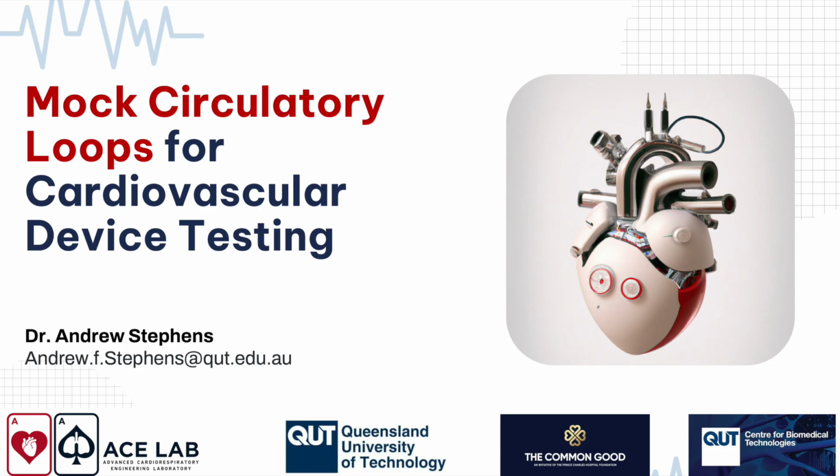So, total artificial heart, do I need all of this? The answer is actually, a lot of this stuff we've talked about, no. But if I just told you what you needed to build for a mock loop for a total artificial heart, this talk would have been over in like 5 minutes. It also depends on what kind of pump you're developing. So if you're developing a pulsatile flow total artificial heart, you will need most of this. Of course, you won't need the ventricles, atria, a Frank-Starling mechanism, or valves, because that whole heart has been taken out. But the other systems will be really important for making sure that you're getting the correct pressure waveforms coming out of your pump and into the body.